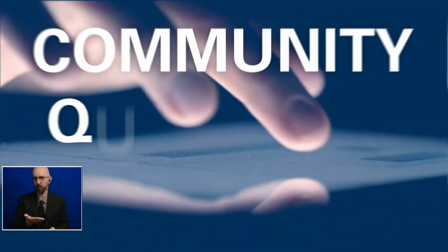Let's get to some questions from our viewers this morning. Lisa wants to know, is DBS only for generalized epilepsy or focal as well? Deep Brain Stimulation is FDA approved to treat focal epilepsy, actually. It does not yet have FDA approval to treat generalized epilepsy. So in treating you, we were doing it off-label, using a known approved medical device to treat someone who has generalized epilepsy. There's a lot of research being done currently in this field, and based on that research is how we recommended this surgery to Amy, because we knew there were good results being published. Even though the FDA approval wasn't there yet, it seemed like the best option for her. This is why we offered it.